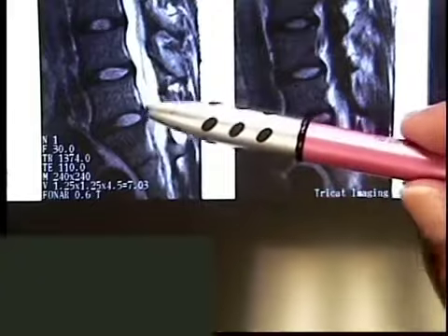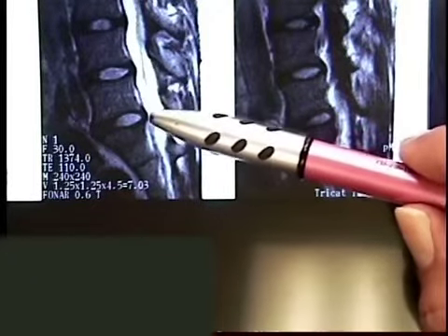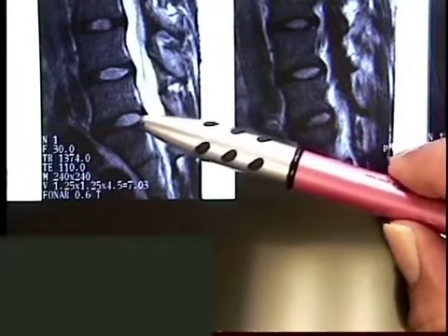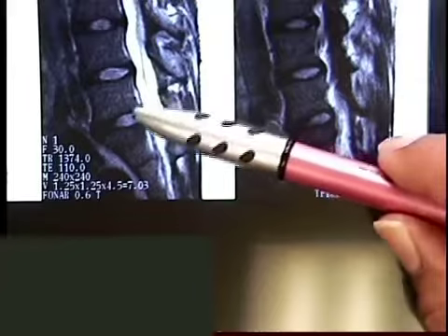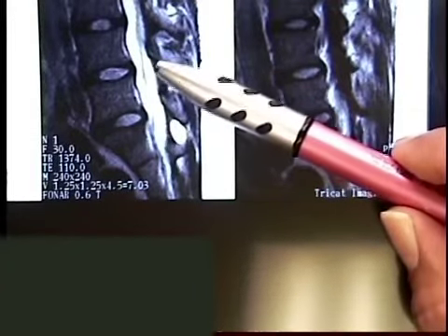So we were talking about the bulges, so here's that back wall, the disc that's just bulging out somewhat. Here's the central portion or nuclear material of the disc. It's not protruding out through it, so there's no what we call extruded herniation, but the back wall is sagging backwards — you can see it at these couple of levels.